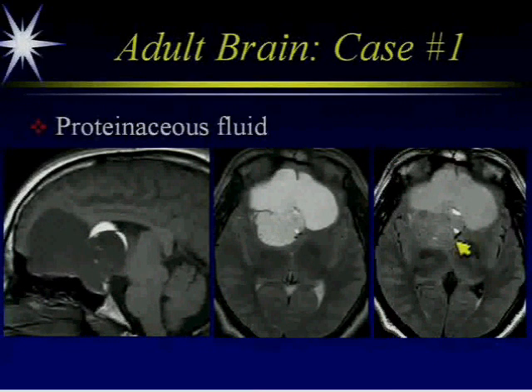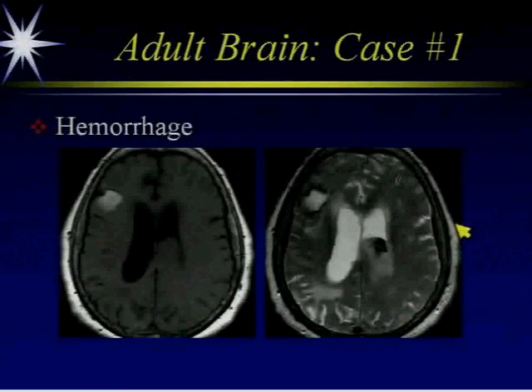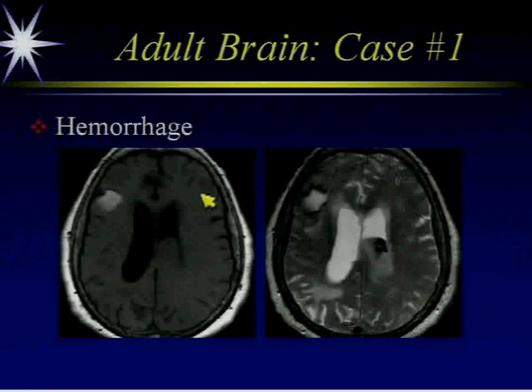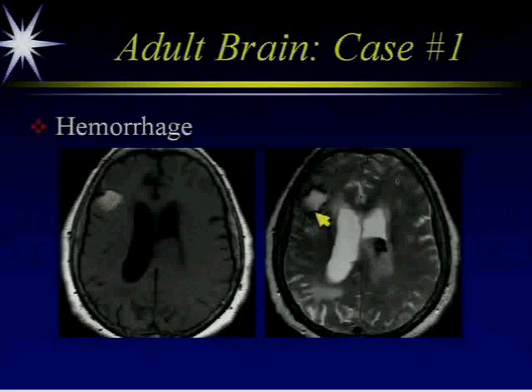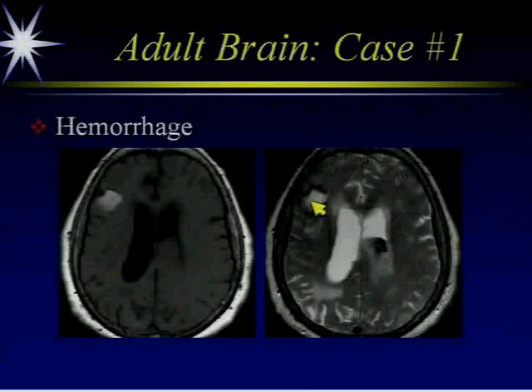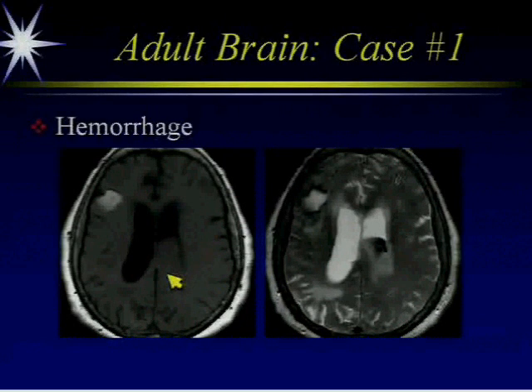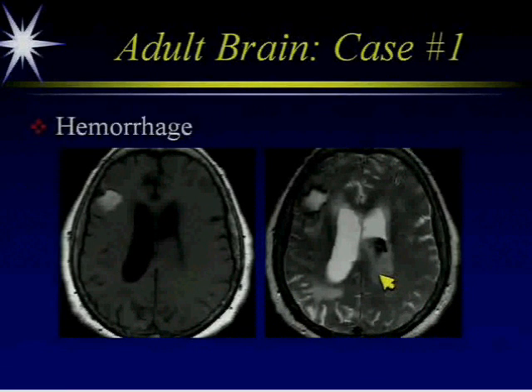Hemorrhage can also be bright on T1. This is a patient with amyloid angiopathy — we see a lobar hemorrhage here. This is a chronic hemorrhage; it's intrinsically bright on T1 and also bright on T2, which is extracellular methemoglobin, and it has the nice hemosiderin rim. This patient also has an acute component with iso to slight intensity on T2 and dark signal — that's a mixture of oxy- and deoxyhemoglobin. Melanin can also be T1 bright; here is a patient with melanoma showing bright T1 signal from the paramagnetic effect of melanin.